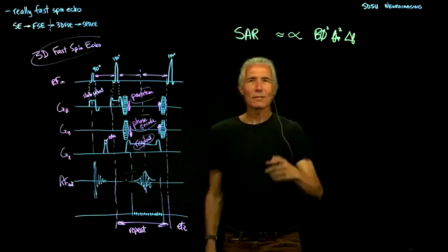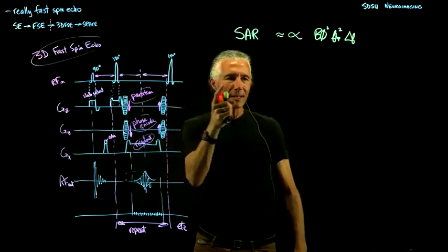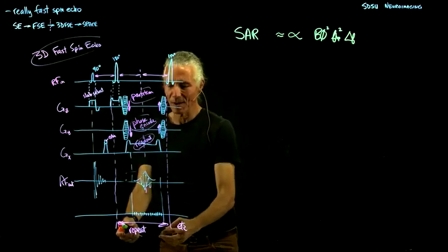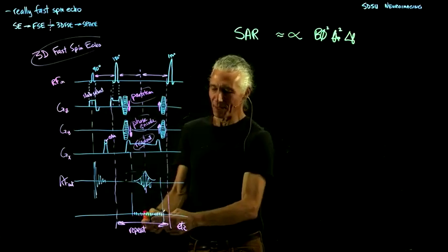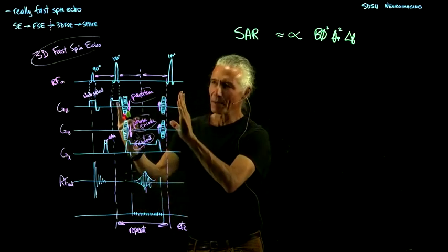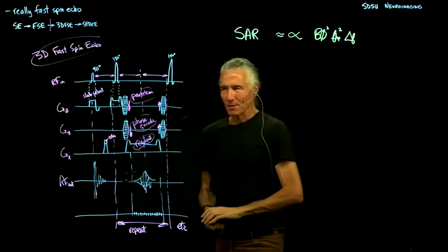So this is a problem, especially for a pulse sequence like this that's going to have a zillion 180s, because remember how many lines of this we have to collect. This is just one line of data. It might have 256 points, but we need to collect 10 million data points. So we're going to need like 64,000 repeats of this. So 64,000 180s. That's a lot of 180s. And so there's a problem with this.